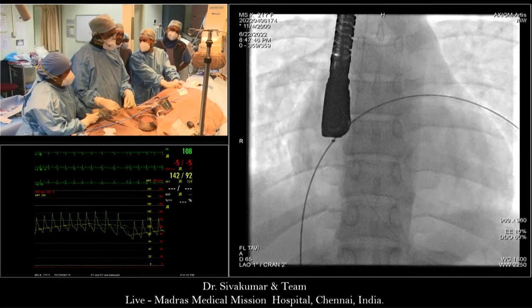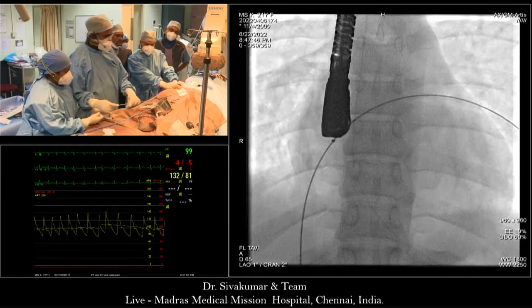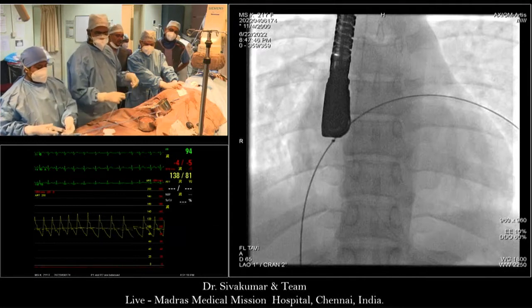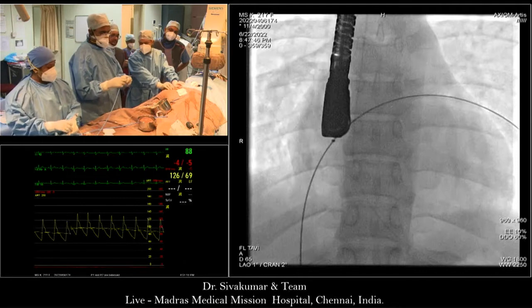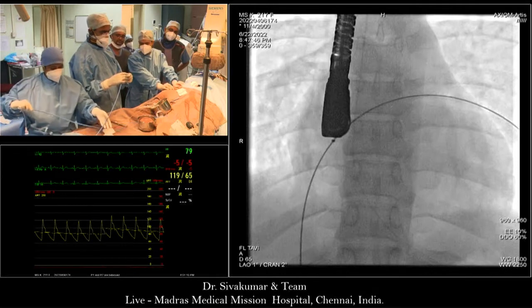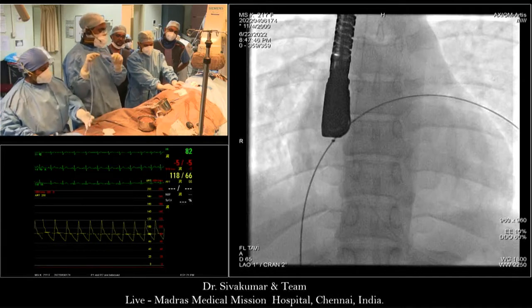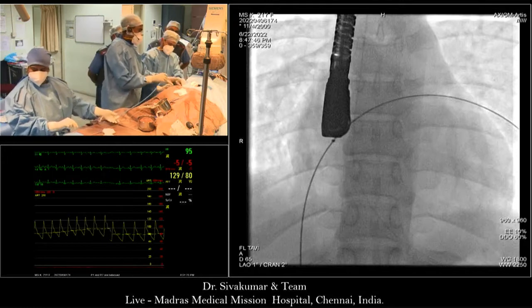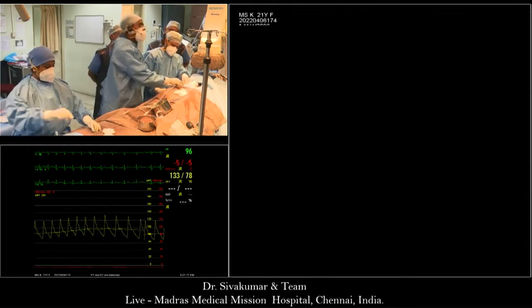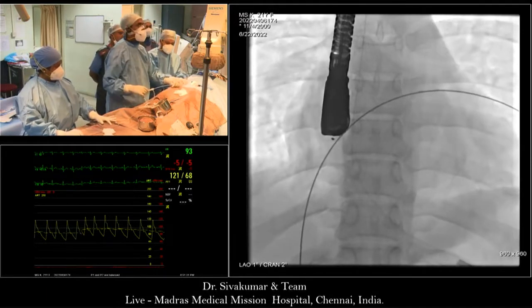The multiple device system should be addressed later after a lecture on that topic. But no other questions. We have Mario there. Mario, what would you think, 36 was too small or 40 too big? Well, based upon the immediate results, obviously the 40 was too big and the 36 was too small.